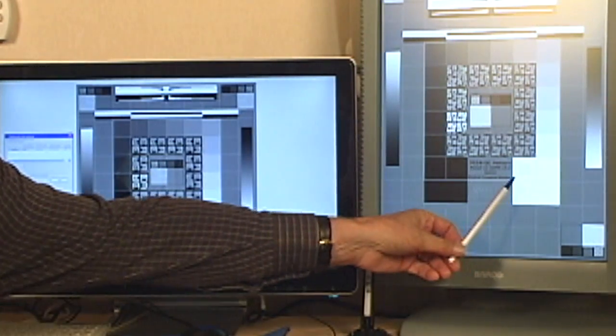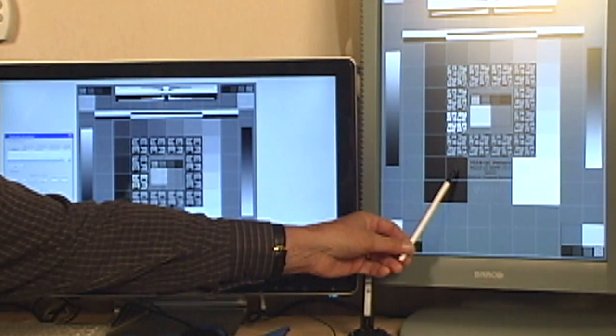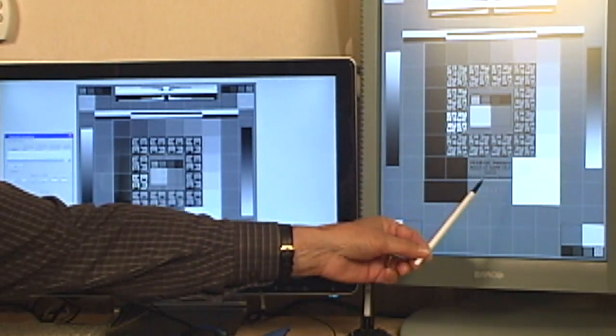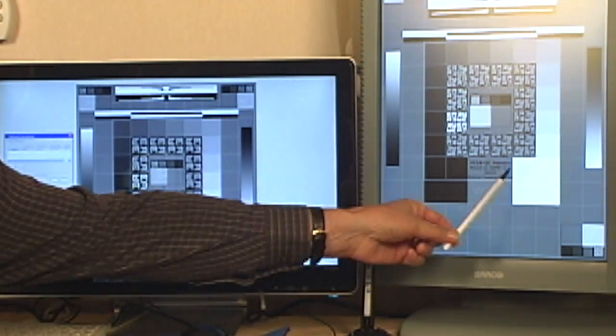But there are basic keys on this, and those looking at the SMPTE pattern will probably remember a 95% square embedded within a 100% luminance square. The luminance 100% is really whatever the display is set to. And then there's a black square here with a 5% in it. What this should look like visually to your eye is equal acuity. In other words, the one in a bright block should be just as easy for your eye to pick up as the one at 5%.